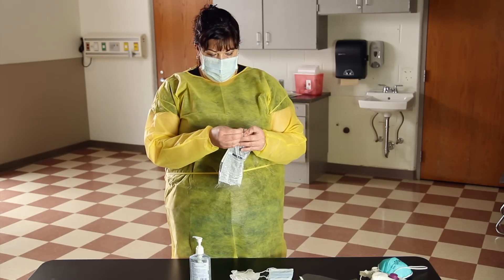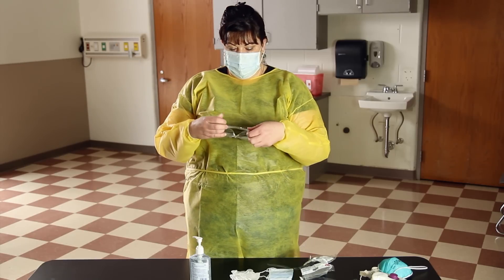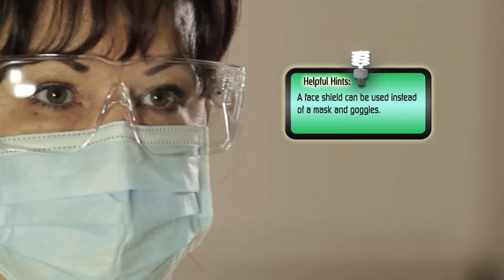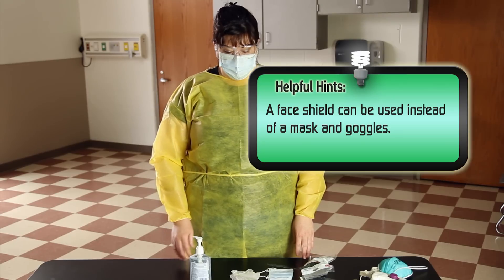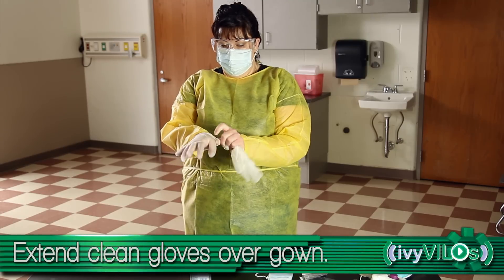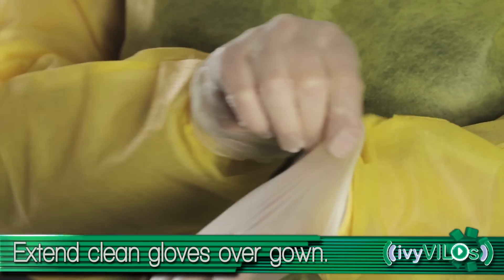If goggles need to be used, place over your eyes and adjust to fit. A face shield could be used to take the place of mask and goggles. Put on clean gloves and extend gloves over the cuffs of the gown.